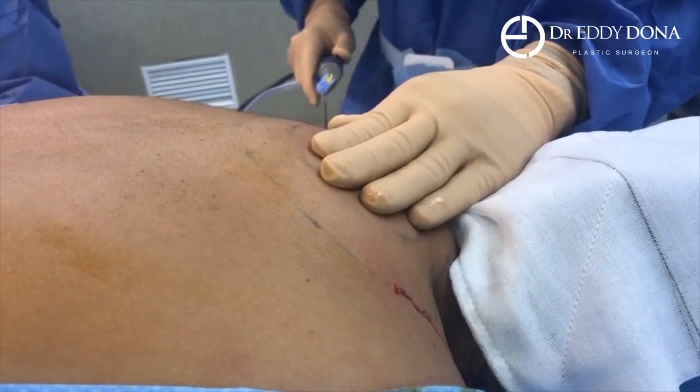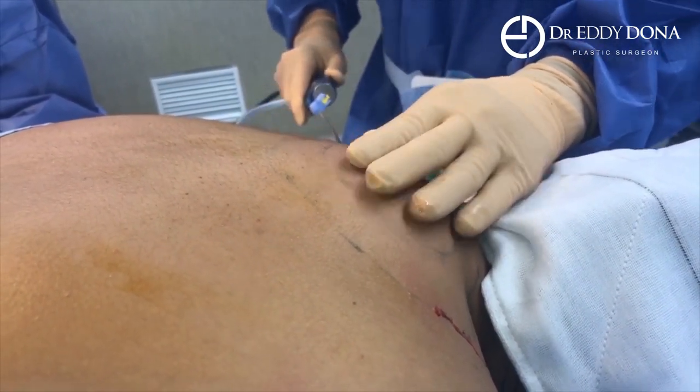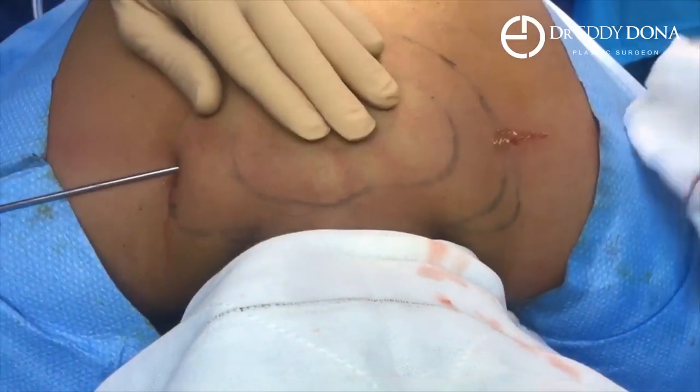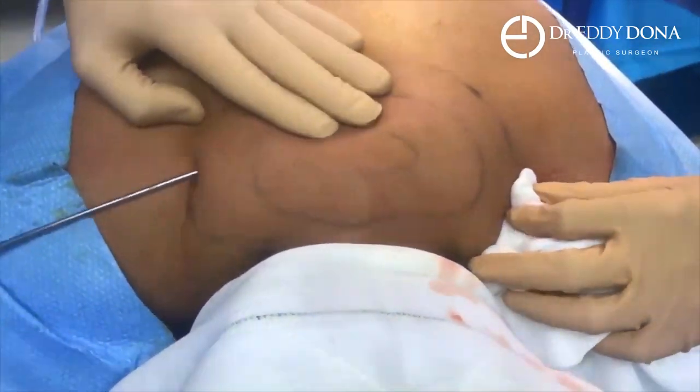We just gently work this area, trying to break up all that fat as much as we can — it's quite tough fat through here. We're also doing it from the other side, just tackling it from different angles to break it up and make it as smooth as possible.